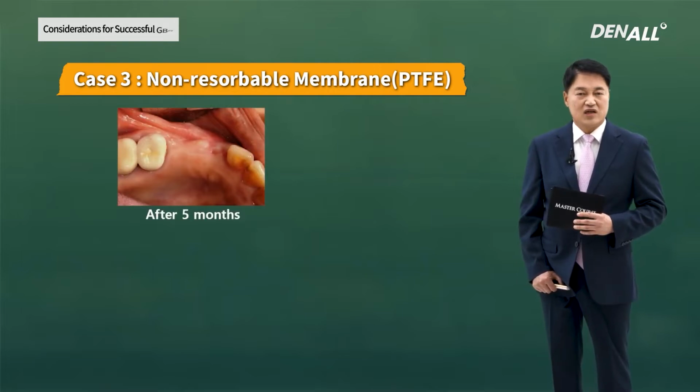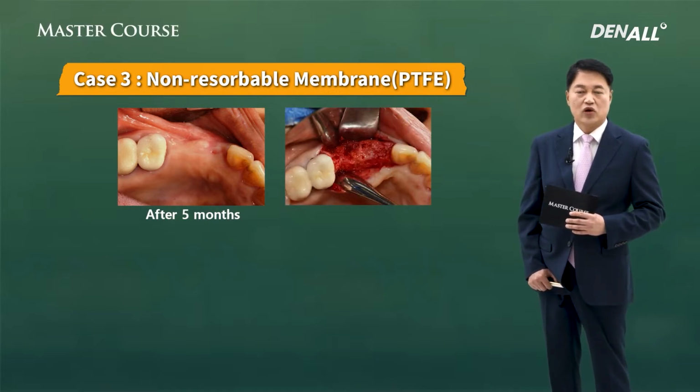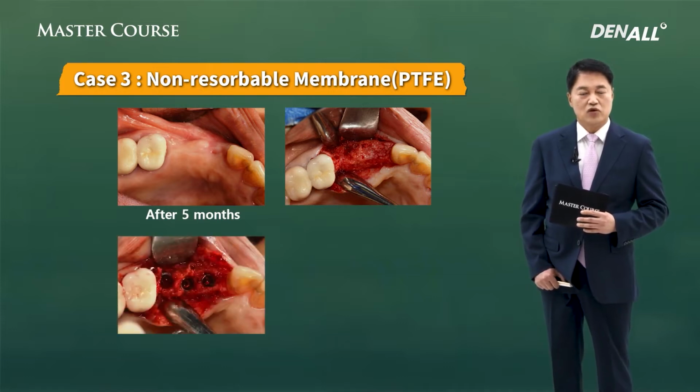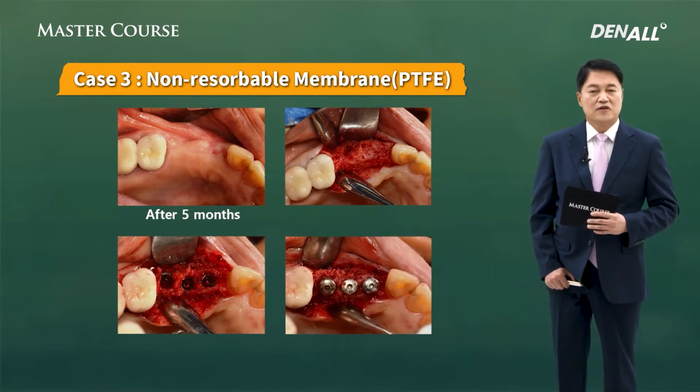Anyway, I removed it, and this is 5 months later. This is when I tried to place the implant. So GBR was rather successful, and I placed the implant. This is after implant, and additionally bone graft was done. 1-stage surgery was done.